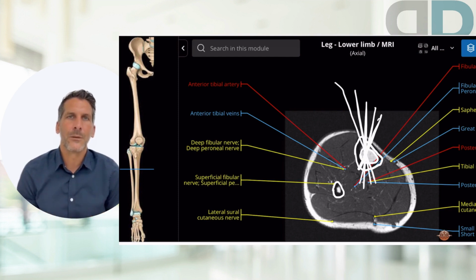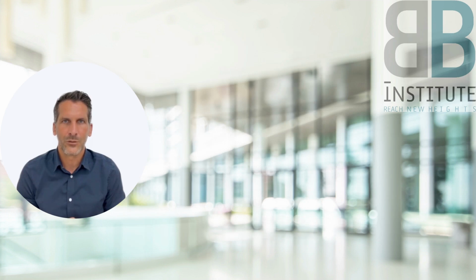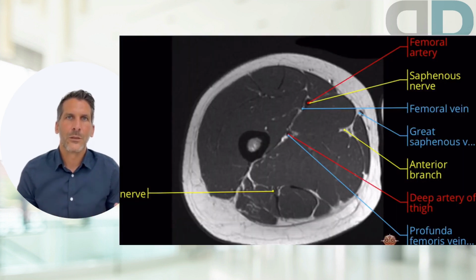An exception is the fibula. The fibula can only be cut from the outside, as the medullary cavity of the fibula is too small for an internal cut. In contrast, I prefer the internal cut through the identical incision needed to insert the nail so that no additional cuts or scars are created. However, you need special equipment for the internal cut.